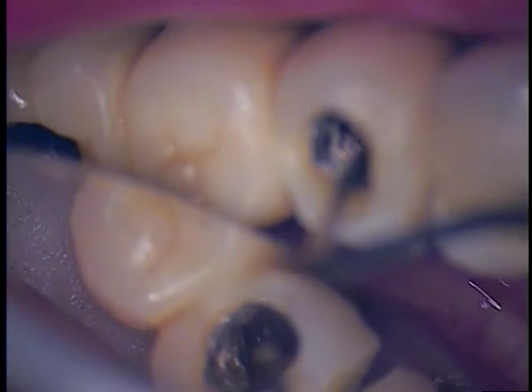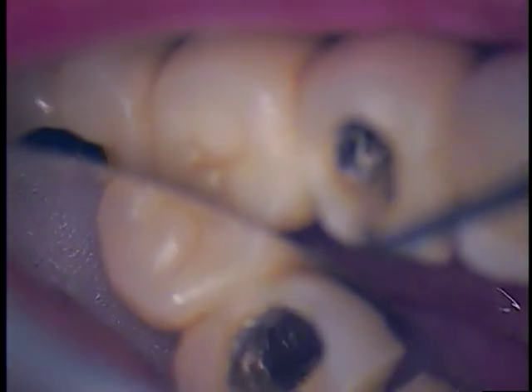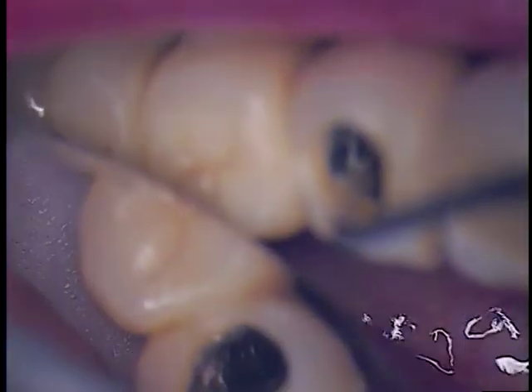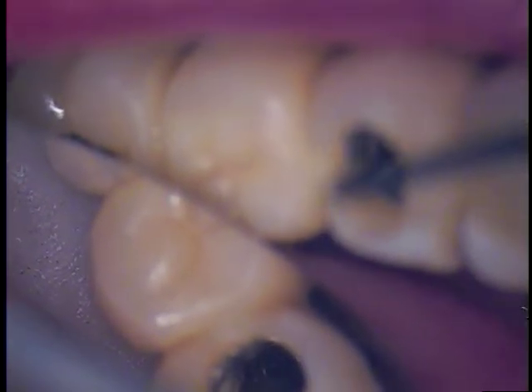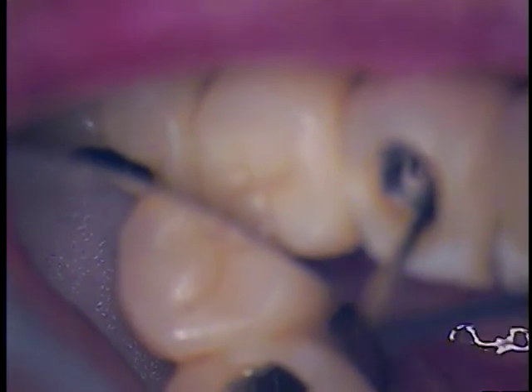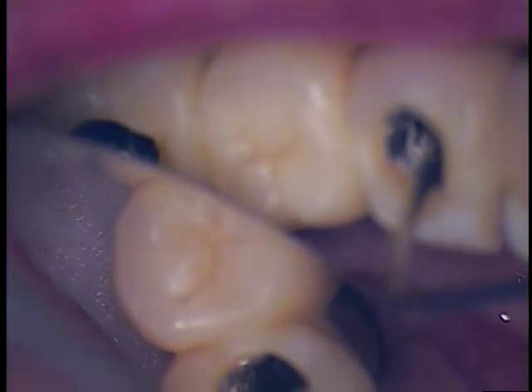I have to do a little more manipulating with the long explorer from our endodontist people. It'll look kind of rotational — let's see how I'm moving it, let's see if it'll move again. It's hard to get something that's small enough we can spin it; it has to be with sharp instruments. I'm going to hang out a little bit more. Once I get this one completely loose, then this whole bridge will just pop right out, hopefully.